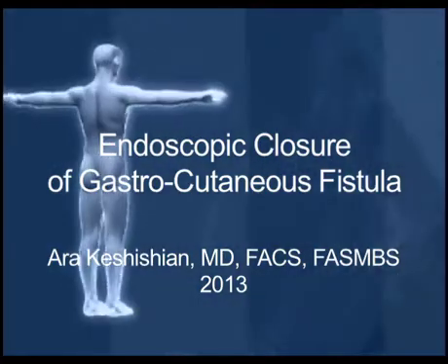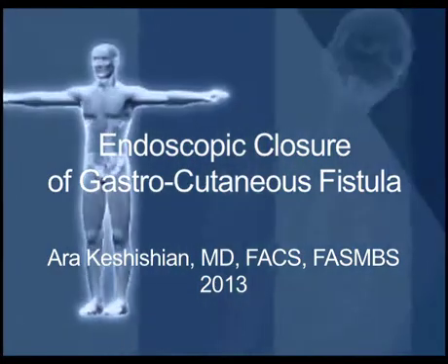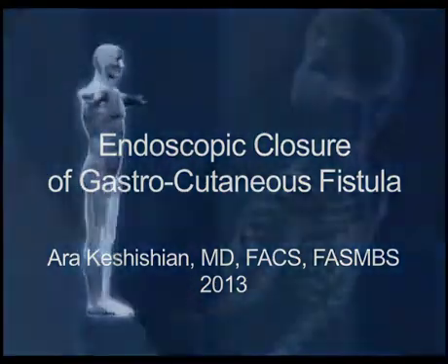Hello, my name is Ara Kashishian and we're going to review an endoscopic closure of a gastrocutaneous fistula. This is a patient who, months after her weight loss surgery — laparoscopic duodenal switch — presented with some vague abdominal pain and a minimal amount of drainage from one of her port sites on the left side of the abdomen.